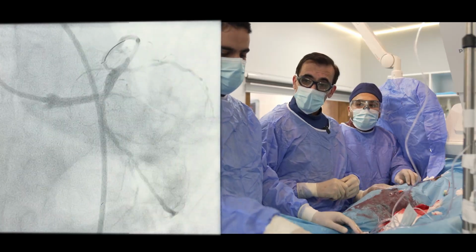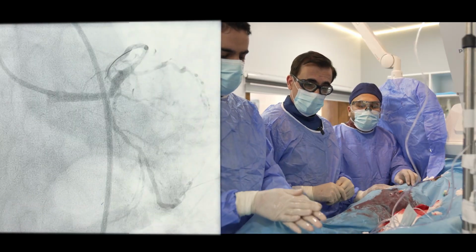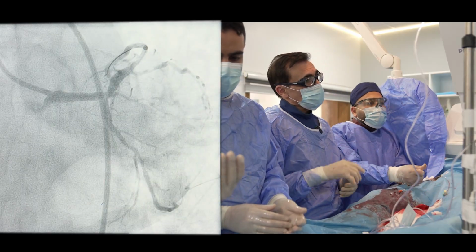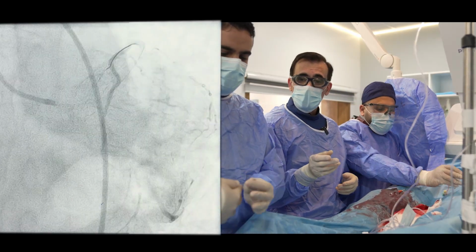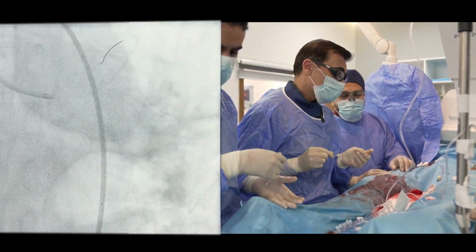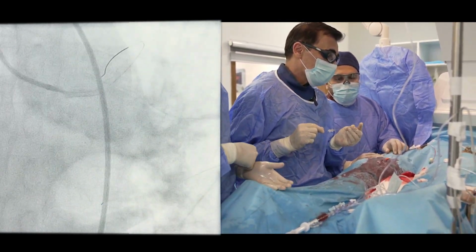And I think we are going to do IVUS for the circ for two reasons. To see at the mid part, maybe we need to stent it before stenting the left main. And the other is to look at the ostium.